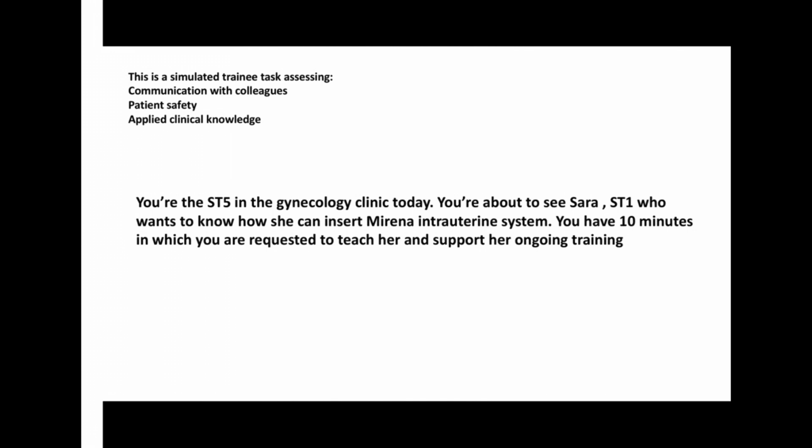One of the complications for anything that may be introduced inside the uterus is uterine perforation. So we can tell the patient that sometimes making a hole in your womb can happen, and it can be very simple. If we suspect that, we will stop the procedure. We may need to take the coil out again, and you may need to stay under observation for 24 hours. However, if the hole is too big, or you are actively bleeding or deteriorating, we may need to do a keyhole surgery to repair this hole.